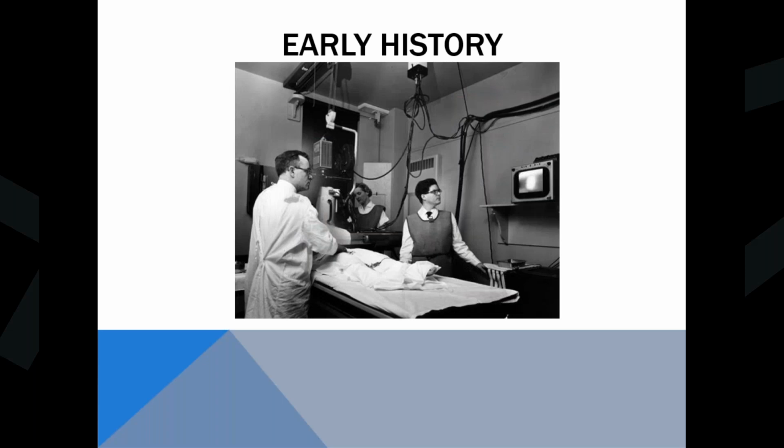So here's your image intensifier right here, and up here you have your camera that's recording the video, and then it would be displayed on this screen here so that the radiologist or cardiologist could continue on with their procedure. I have to laugh that asking a cardiologist or a radiologist to use this as their reference screen would be a little challenging in this day and age, considering how big the screens are now.